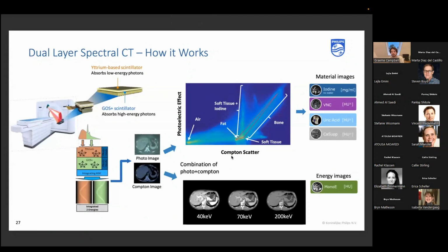So these are how those limitations of CT pertain to MSK. Now I just wanted to show this again, when we're looking at the different materials. I talked about bone here, iodine is here, for example. If we're looking at MSK, this is kind of our realm of materials. So really looking at water or blood, fat, or bone marrow, yellow marrow, and bone.